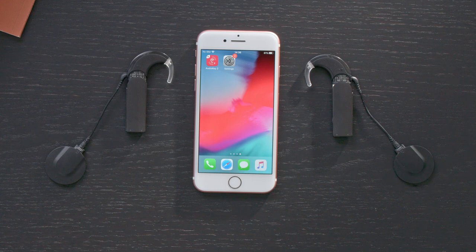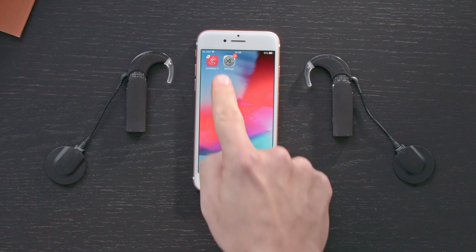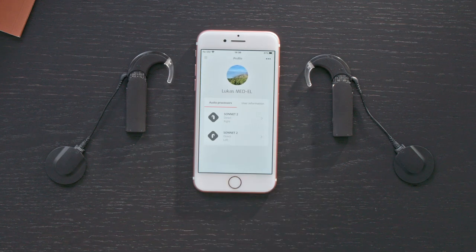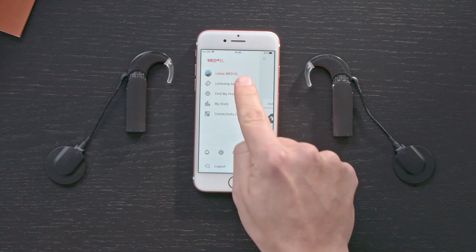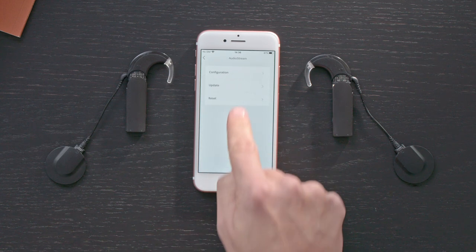Make sure AudioStream is turned off by removing it from your audio processor. Open the AudioKey2 app, press the menu in the upper left corner and open Connectivity Options. Select AudioStream and then Configuration.